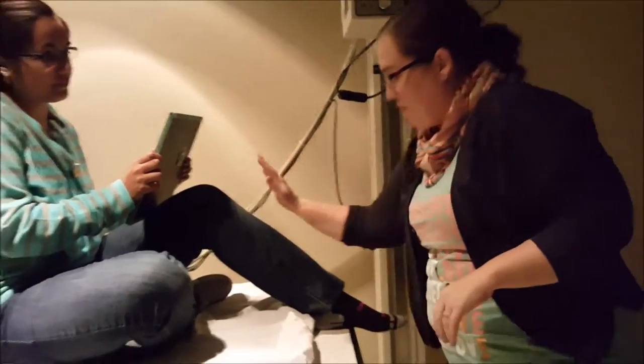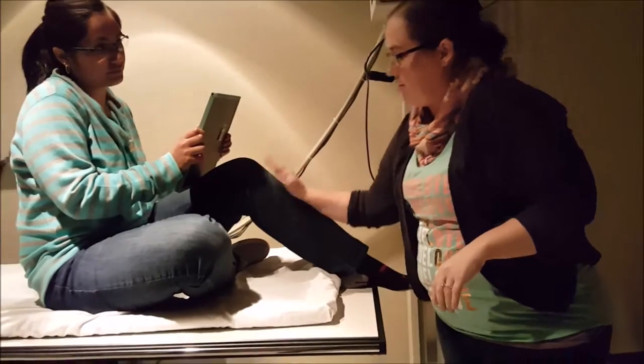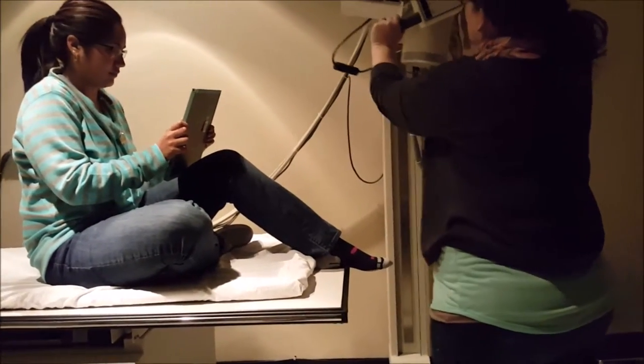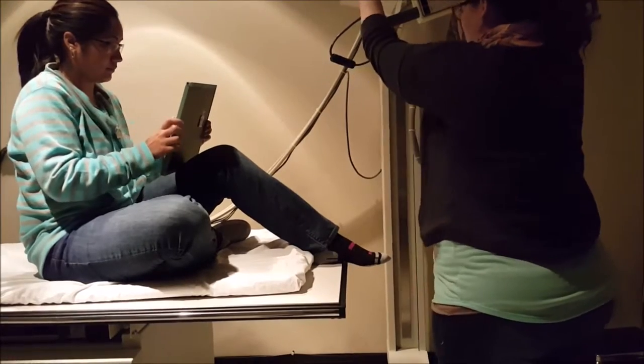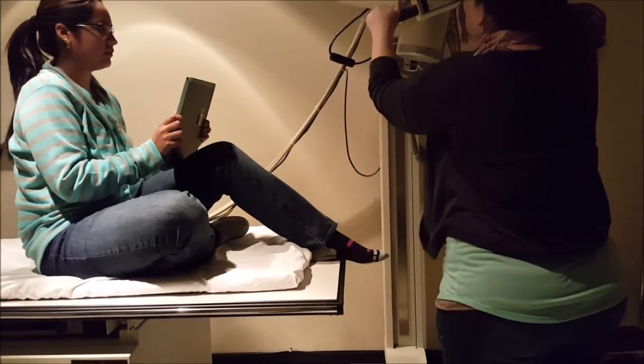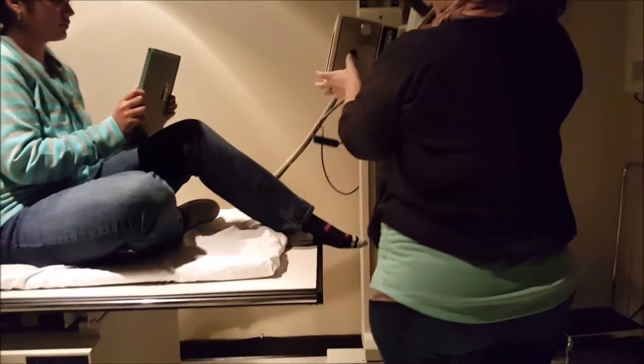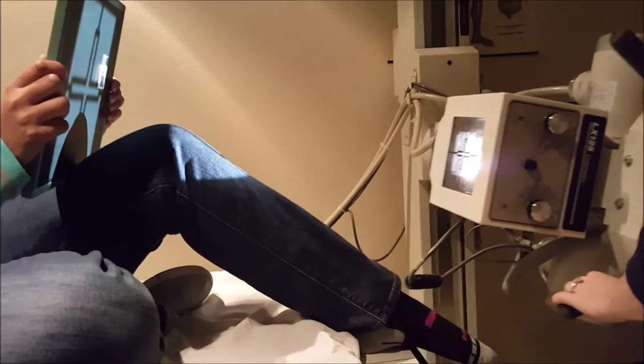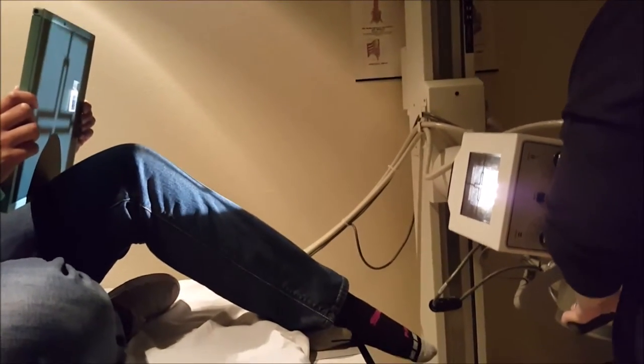Now you want to be 10 to 15 degrees from the leg. That tends to give you the best image of the patellofemoral space. Sorry, I'm blinding you.